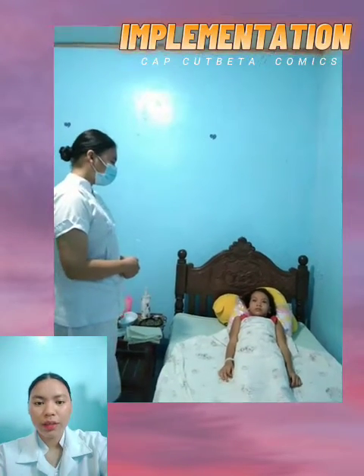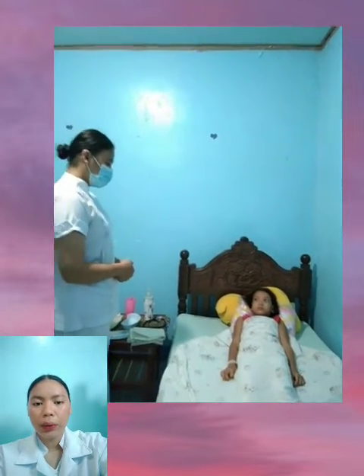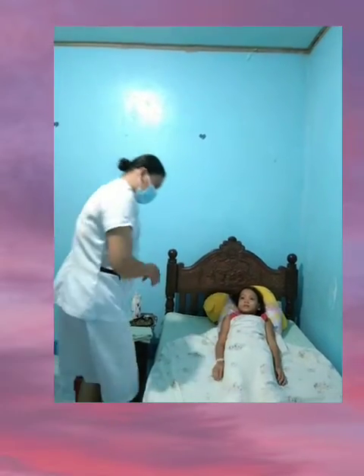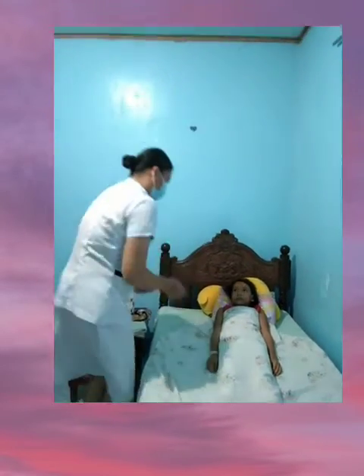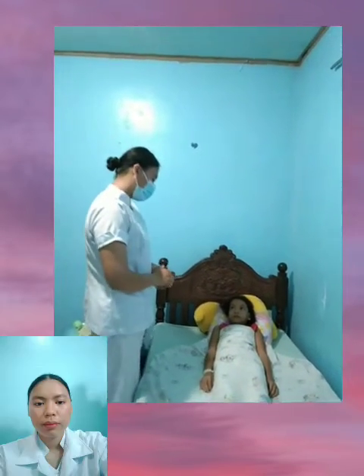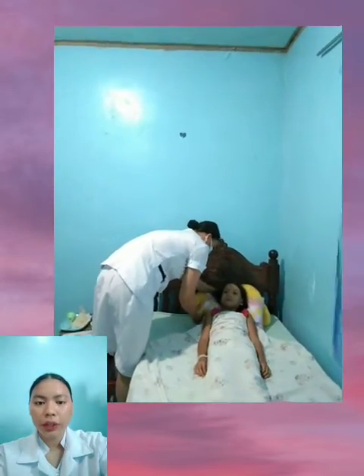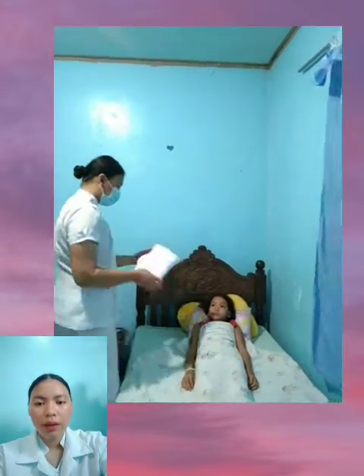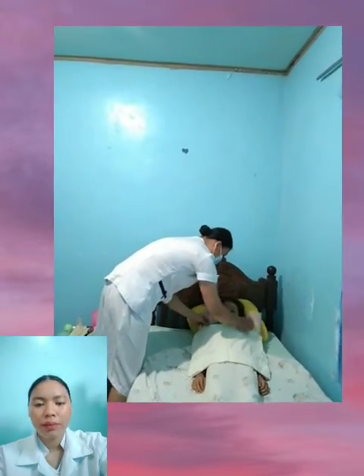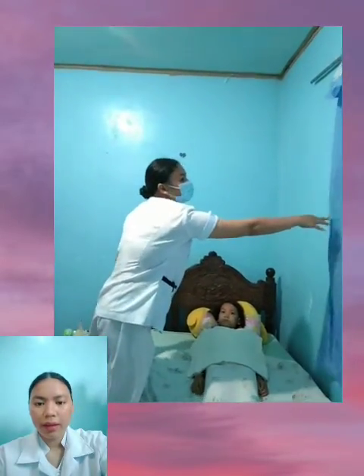For the implementation, introduce self and verify the client's identity using agency protocol. Explain to the client what you are going to do and why it's necessary. Assist the client to a high Fowler's position if his or her health condition permits and support the head on a pillow. Place a towel or disposable pad across the chest. Provide for the client's privacy by closing the window or the door in the room of the client.